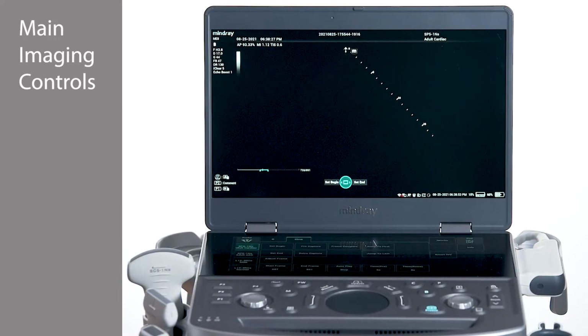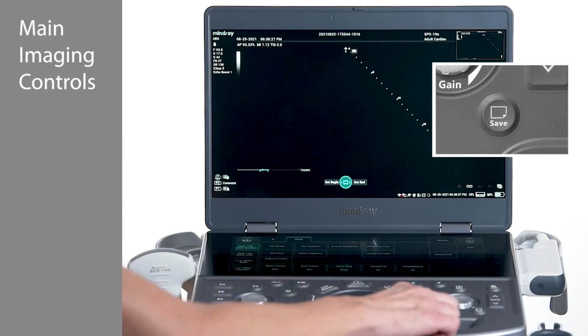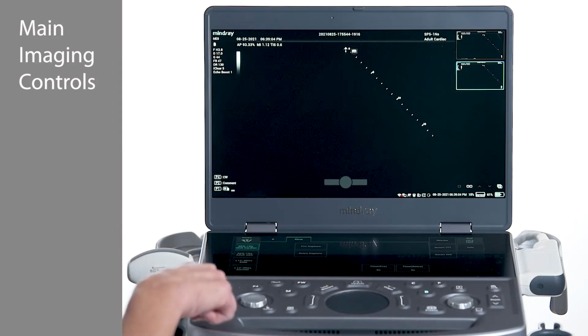To save an image, press freeze and the save key, or save an image on the fly by simply pressing save without freezing. To save a clip, a key can be configured in the setup menu to perform this function.